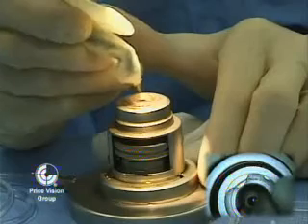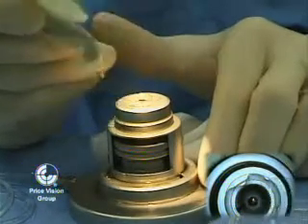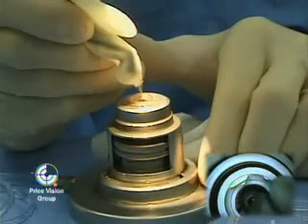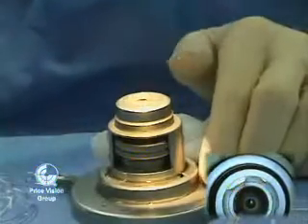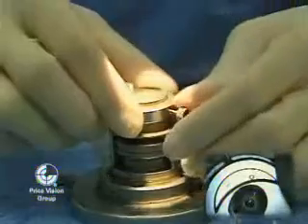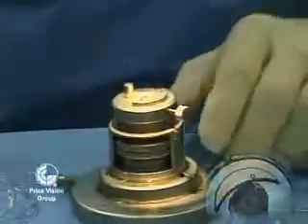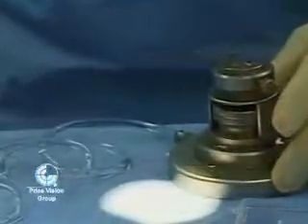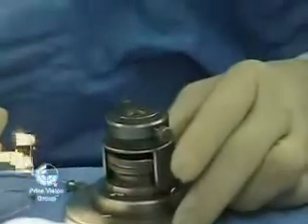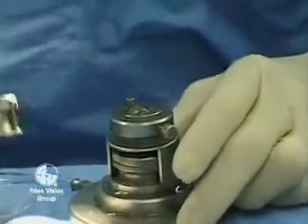We're now measuring the thickness of the donor cornea, and this will give us an idea of which microkeratome head we want to use so that we end up with a deep dissection that's approximately 100 to 150 microns thick when we actually have the donor tissue. So the thickness I'm referring to for 100 to 150 microns will be the donor tissue used later in the procedure. This is the 300 head of the Moria CB system.